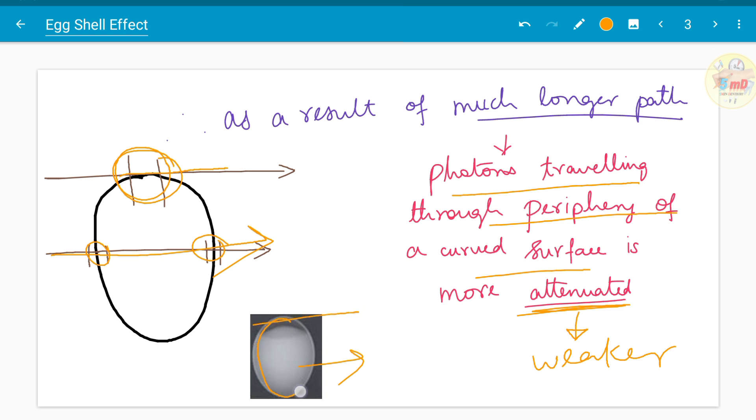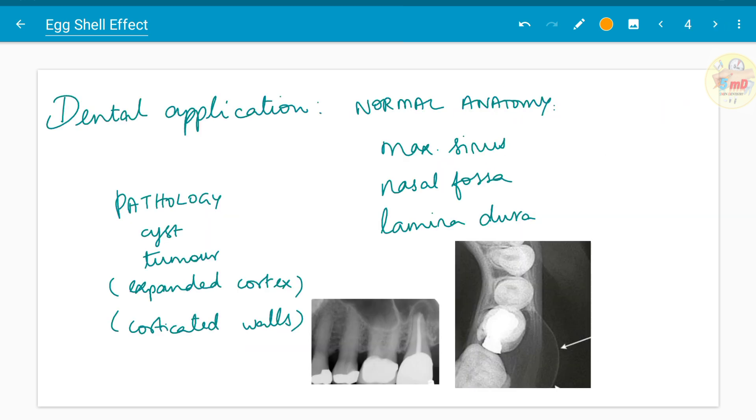That is the eggshell to be more thicker. As I said, the eggshell mimics the cortex, the expanded cortex in normal anatomy such as maxillary sinus, nasal fossa or lamina dura, and in pathology such as cysts or tumors where the corticated walls appear more thicker than the other parts.